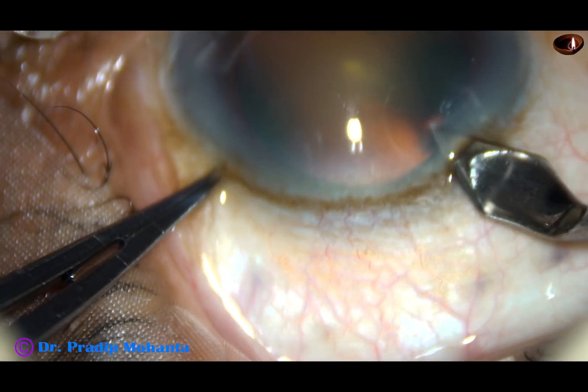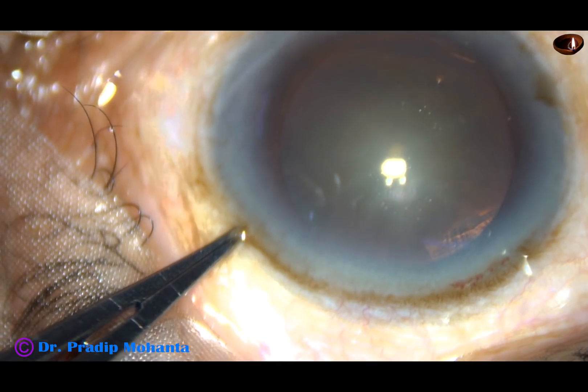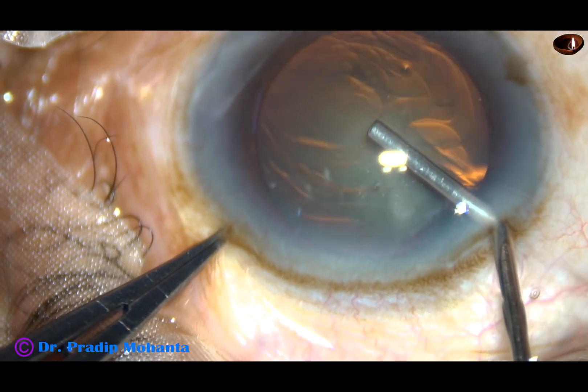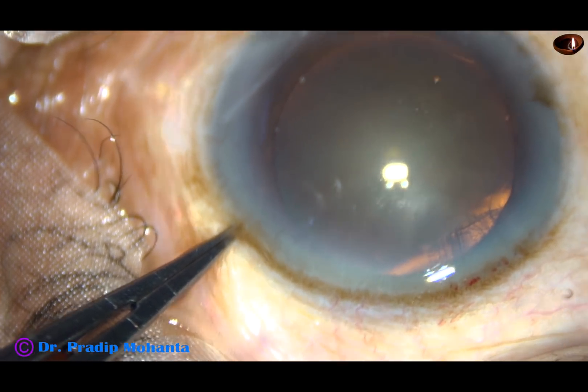In such cases, we should fix the eyeball with the tooth forceps and we should hold the eyeball very close to the limbus. If we hold it away from the limbus, the risk of conjunctival laceration and subconjunctival hemorrhage is much more.